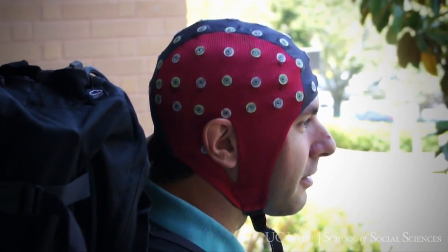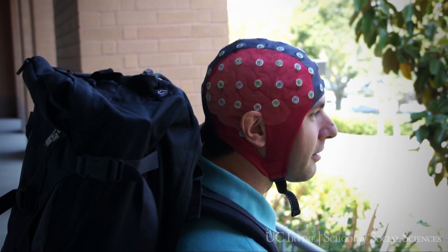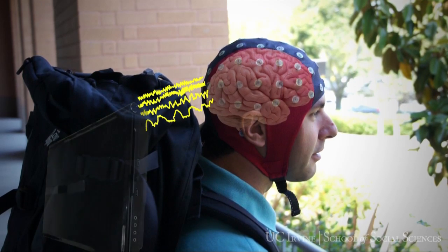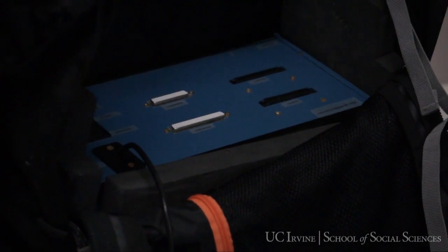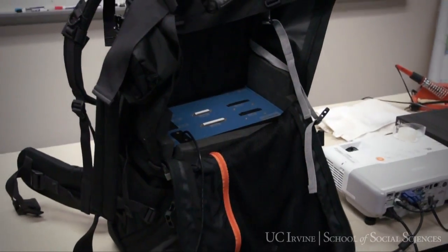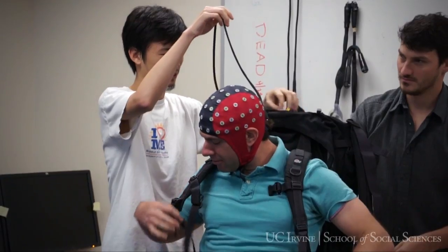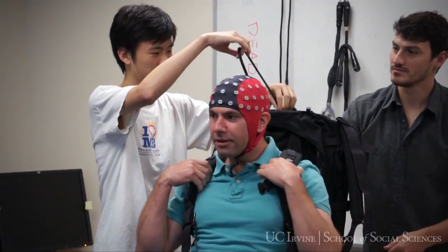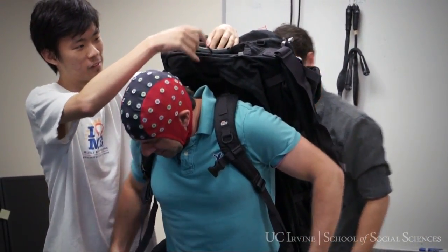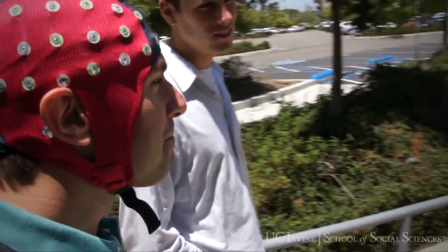EEG is a way to record the natural electrical activity of the brain. The brain generates weak electrical signals that can be measured and sent to a computer. We measure electrical signals using a custom-built EEG system made by Advanced Neuro Technology. This system fits inside of a backpack and can be connected to a notebook computer so that we can process EEG signals while the user walks around.